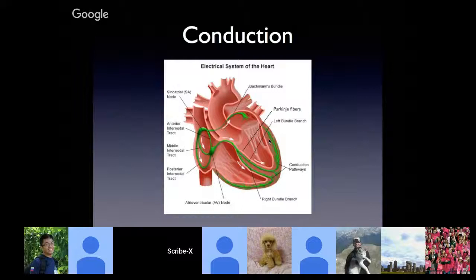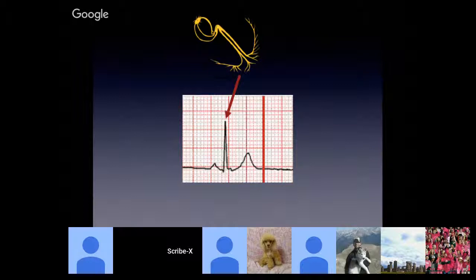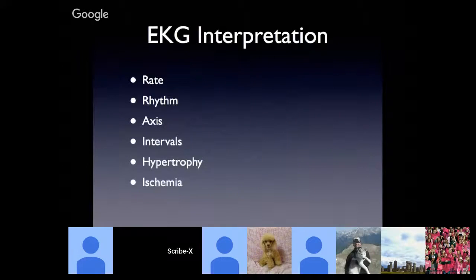And then everybody relaxes, and you get your T wave when the heart muscle cell repolarizes. So it looks like the SA node correlates with the P wave, the AV node results in your PR interval, and then your QRS complex as the ventricular myocardium contracts and propels blood up to the lungs and throughout the body, and then your T wave.